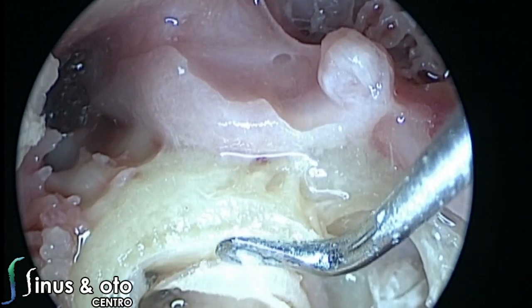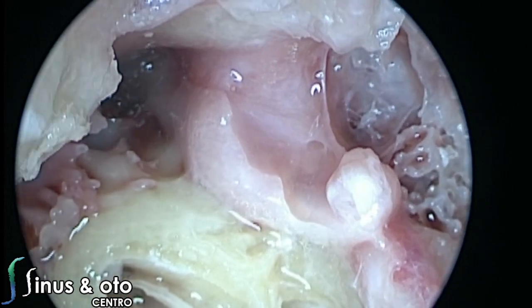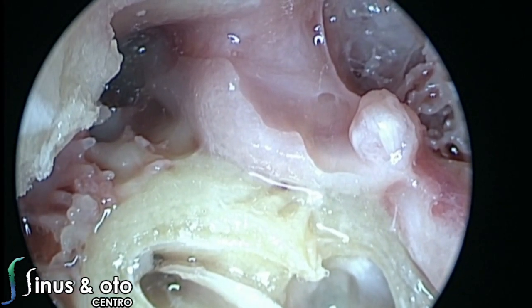Scala vestibuli is over there because it goes directly to the vestibule, and the scala tympani is down there because it goes directly to the round window membrane and the tympanic cavity.